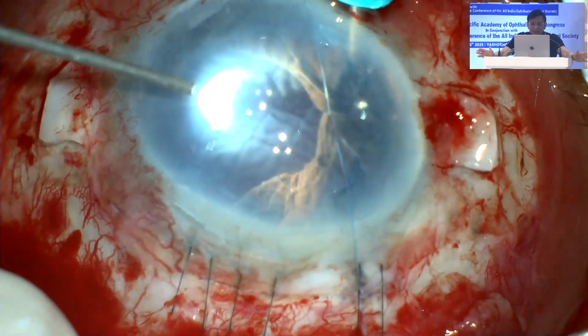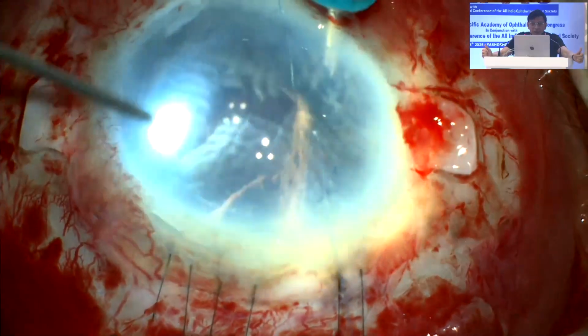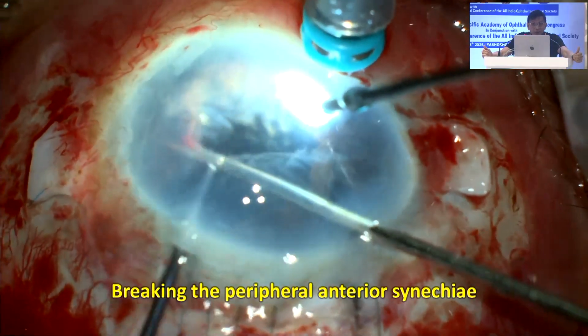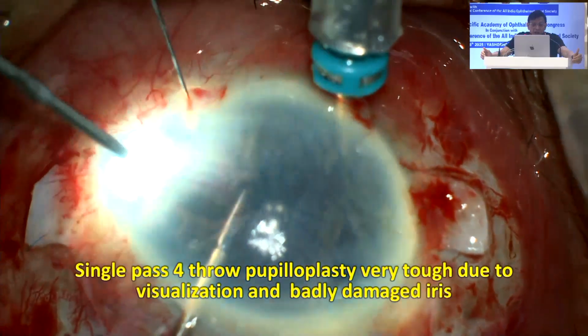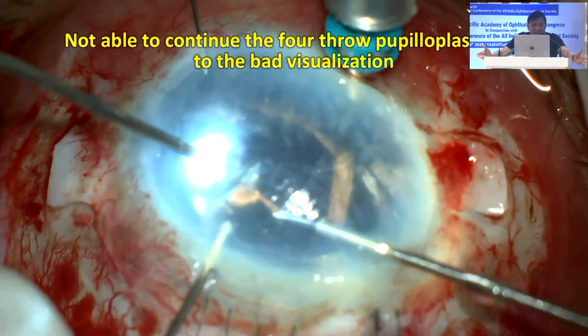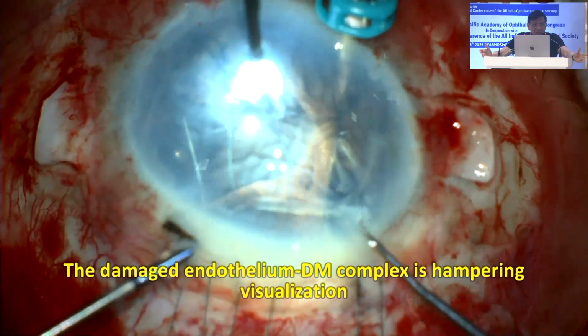Now look, one side I have done. I have to do on the other side. Remember, patient has come from Philippines. There's no way he's going to come back to me. I have to make him all right and send him back in one shot. Now when I started doing the other side, I'm just not seeing. Okay, I'm not able to even see the suture, even with the endoilluminator.